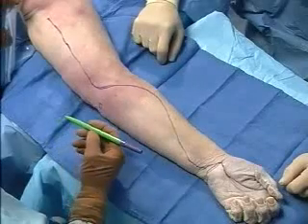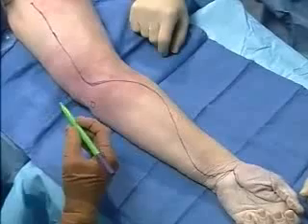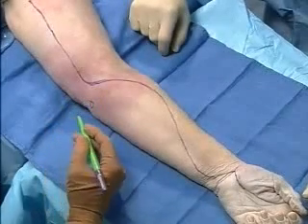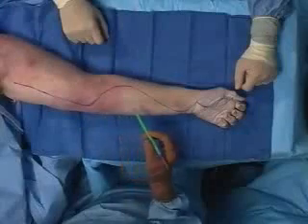We're going to go over the technique of forearm fasciotomy. One of the important parts about this procedure is planning your surgical incision. Your surgical incision needs to allow you to do a number of things.